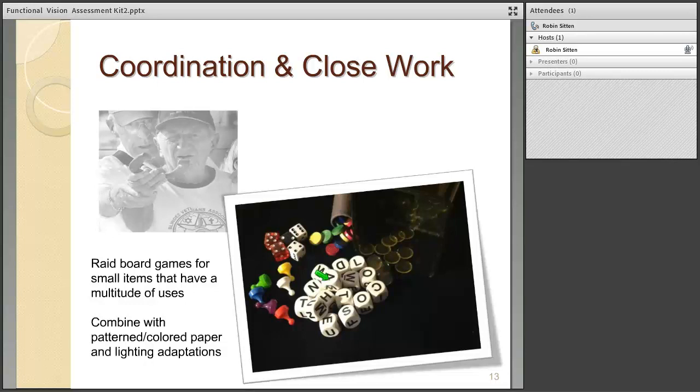The letter dice are from Boggle. I used them in my acuity lab test, and we had a lot of fun with them. Next are standard game tokens and 3 colors of dice. With children, you wouldn't likely use items this small, but they're good for adults in observing their hand-eye coordination and close-up work with small objects.